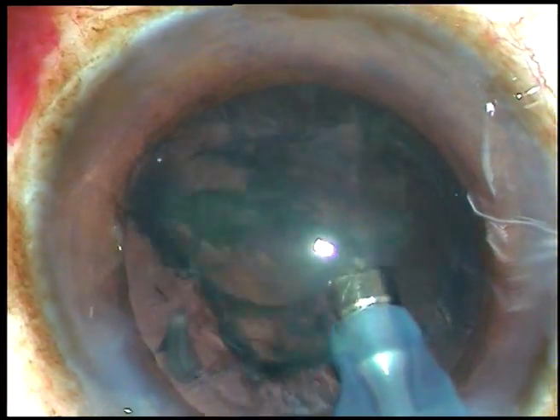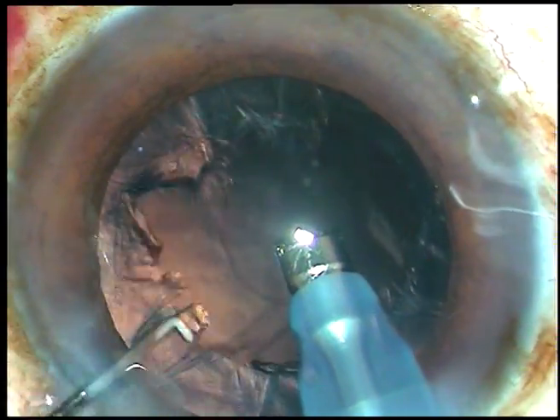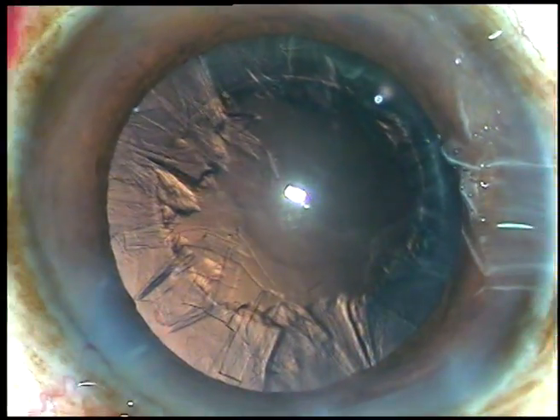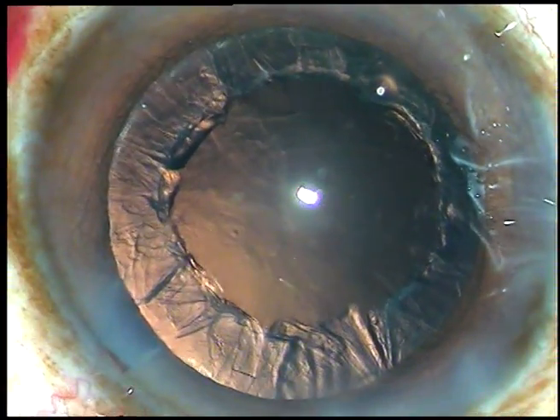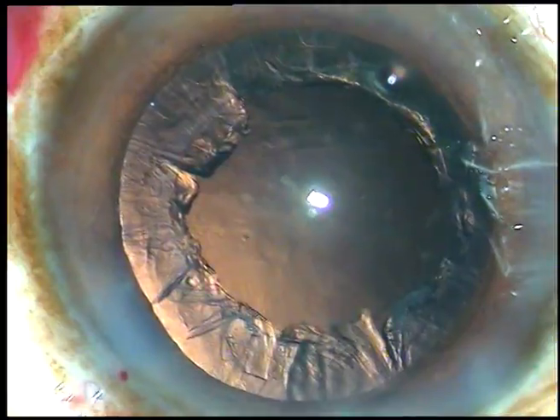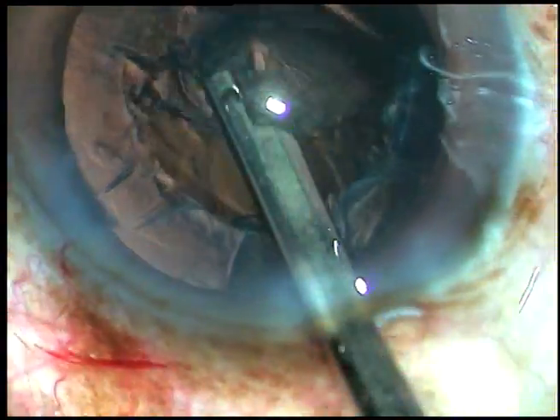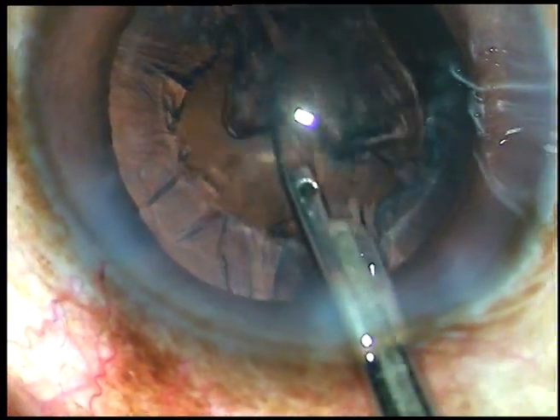And now this is the management of the nucleus. Now some 2% HPMC is injected, and then the cortex is being removed with the help of a 23-gauge Simcoe cannula. See how quickly you can remove the cortex with this Simcoe cannula.